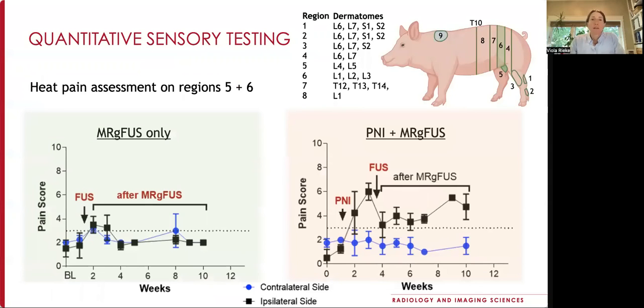Of the different pain thresholds tested, the heat pain threshold showed the largest change. In the animals that received high temperature ablations, pain scored to the heat pain threshold increased over baseline directly after treatment and remained elevated for 2 weeks before returning to baseline.